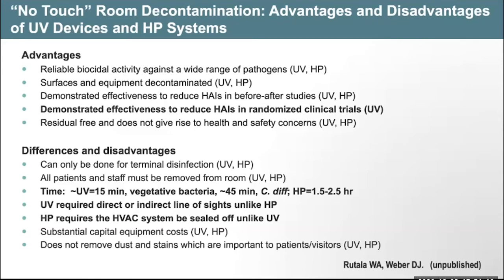Both are residual-free and don't give rise to health and safety concerns after a period of time. Again, they are only done for terminal disinfection. Everyone has to be out of the room. The UV devices are much faster, even when using them against spores, than the hydrogen peroxide devices. UV does require direct or indirect line of sight, so for a bathroom to the side, you have to move the device and do it again.